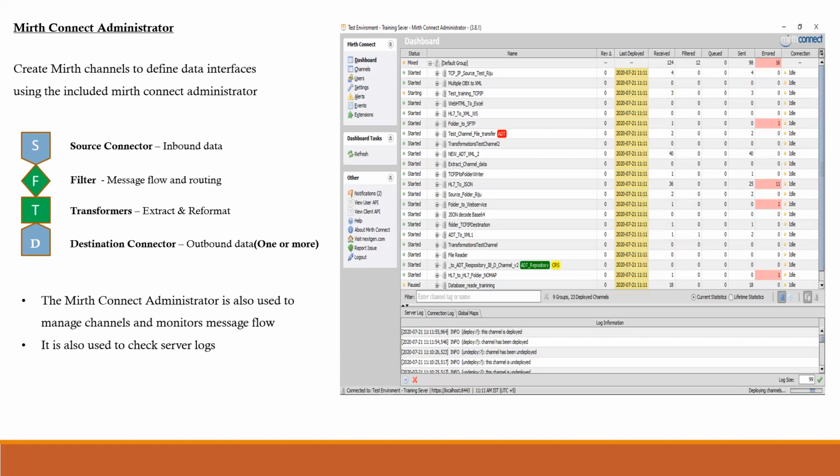That's what we will do as we progress. It's kind of peeling off the layers of the onion. First, you will see the upper layer, and then you will slowly look at the lower layer, and then the inner layer. So we'll be zooming in step by step to understand the architecture in a systematic way.